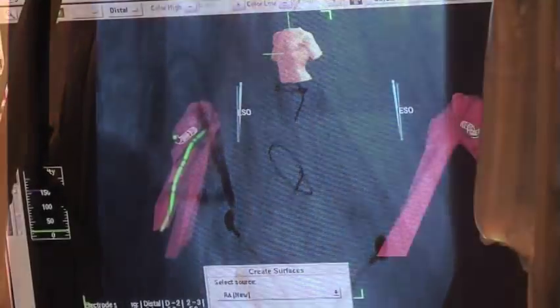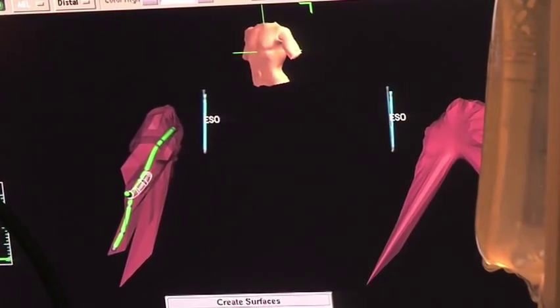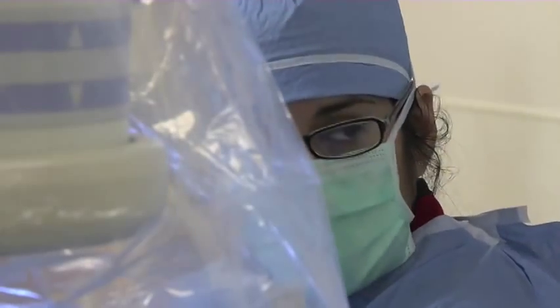The map then displays the electrical activity superimposed on the anatomy. And it sort of gives us a roadmap. And so then we can say, well, there's the interstate that we need to basically put a roadblock in. We would go to it, pace, make sure that was in fact the location that we were looking for, and then started making the ablation lines. Can you live with a heart rate of 70?